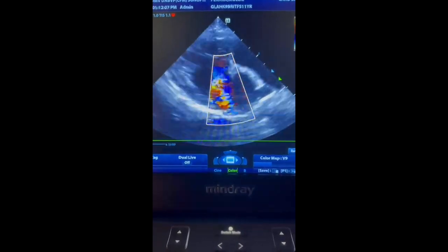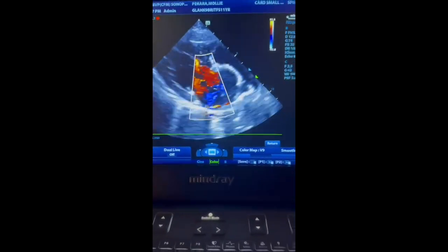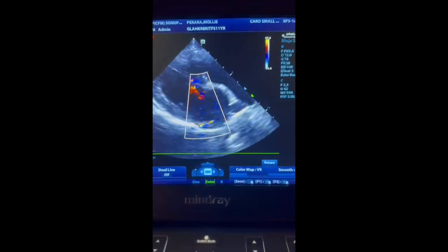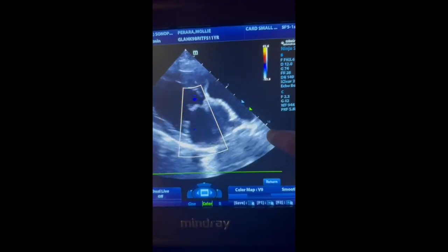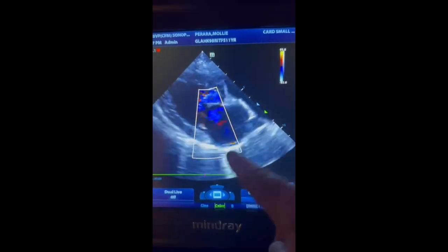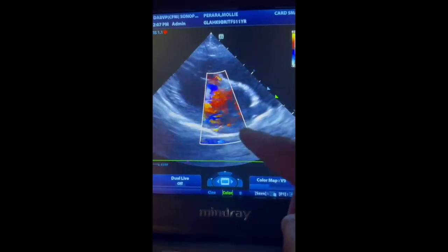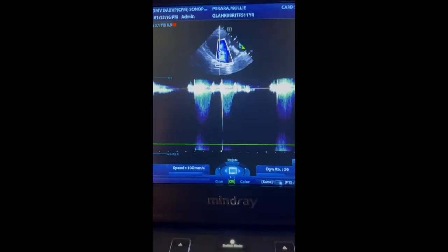So this is a spaniel cardiac, and it has a bigeminy arrhythmia going on, but look at the acoustic power here and the clean image and clean Doppler. And this is what I was talking about. Doppler is the most sensitive part of the scan, and we're 10, 12 centimeters with the heart. Of course, the physics are in our favor because we're going through fluid, and he has some mild volume overload and typical MR, but the color flow is pretty solid even with him moving around.